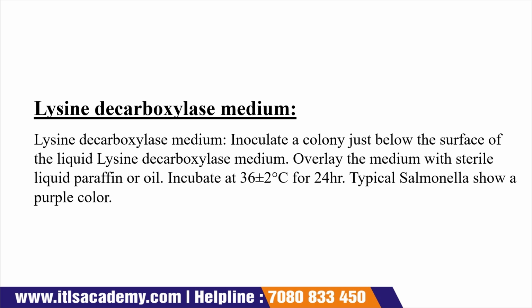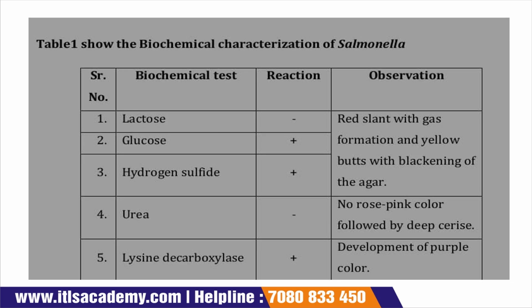Next is your lysine decarboxylase medium. In that case you have to inoculate the colonies just below the surface of the liquid lysine decarboxylase medium and overlay the medium with sterile liquid paraffin or oil and then incubate at 36 degrees Celsius for 24 hours. If Salmonella colonies are there, then it will show purple in color.